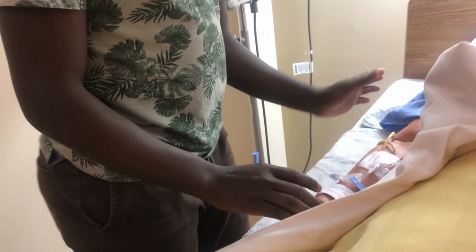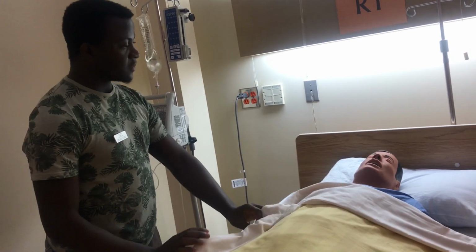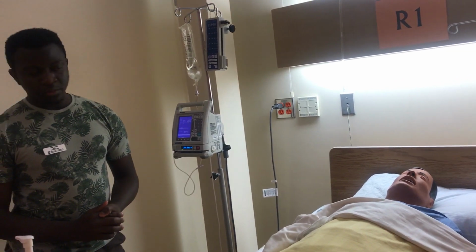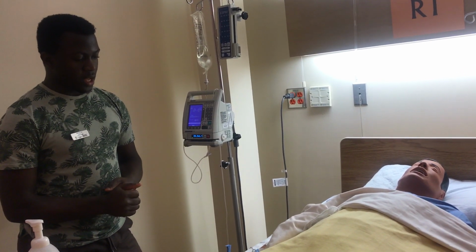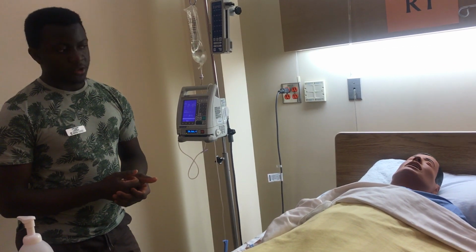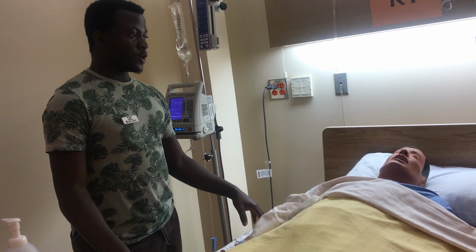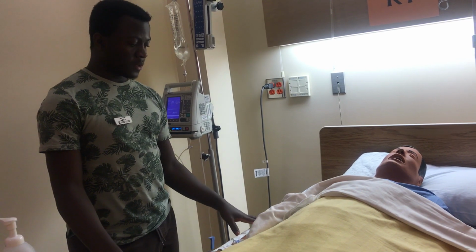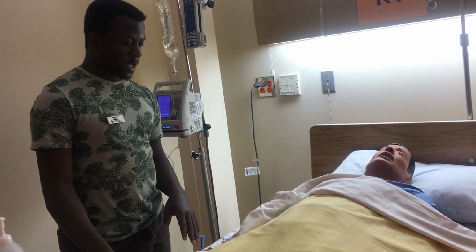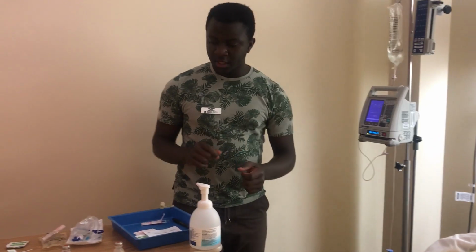And then before this, of course, I would have introduced myself to the patient and told him why I'm there. So, hi sir, my name is Valdo. I'm a student nurse and I'm here to administer your medication. It is methylprednisolone. That's for your information. So I'm here to administer that, and like we've discussed before, some side effect of these medications can be an increase in your blood glucose and your ulcer not healing properly. So you can just monitor for that. I will be checking on that as well. But let me know if you feel any differences, okay? So I'll go ahead and administer your medication now.